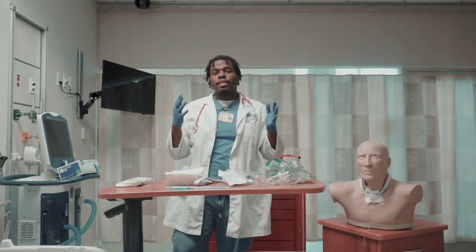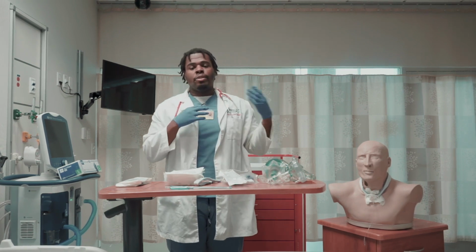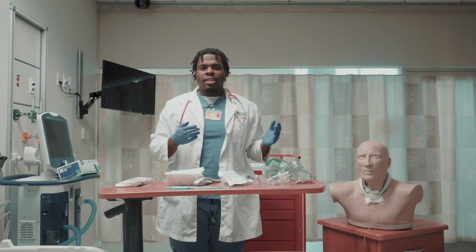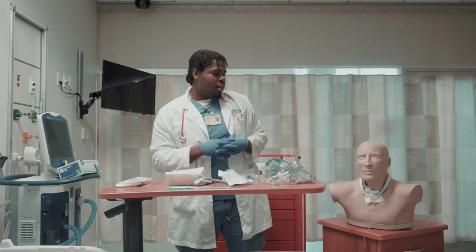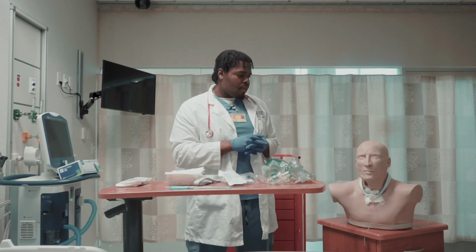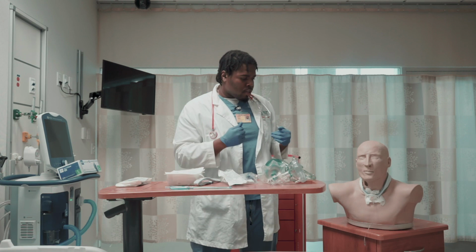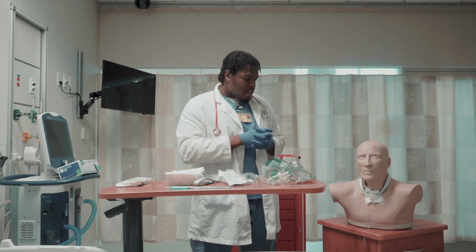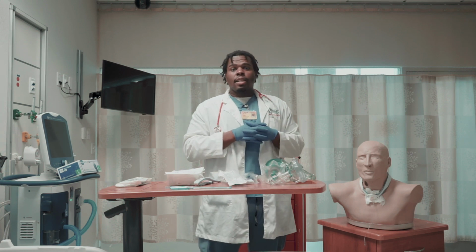After washing your hands and donning the appropriate PPE, you're going to introduce yourself to the patient, explain the nature of your visit, and confirm their identity. Today we have Mr. Jones. Hello, Mr. Jones. My name is Leon. I'm a respiratory care student. Today I'm here to do a trach cleaning, to make sure your trach stays clean. Can I see your wristband? I just need to confirm your identity. Okay, I've confirmed his identity.